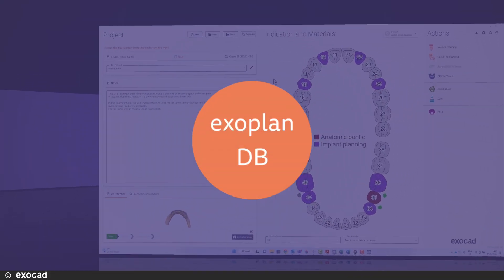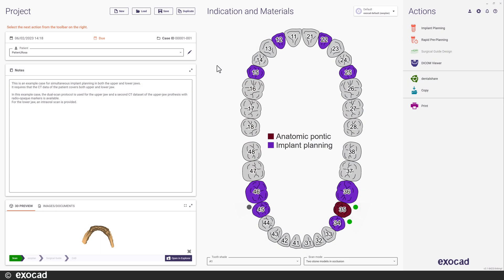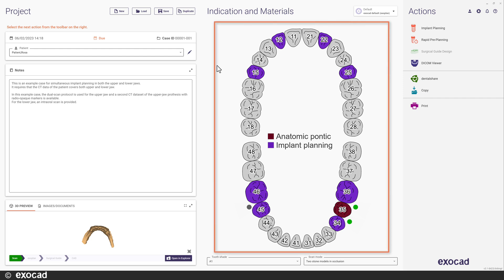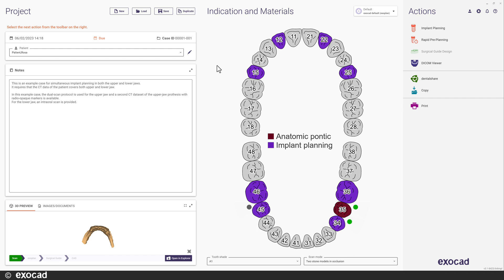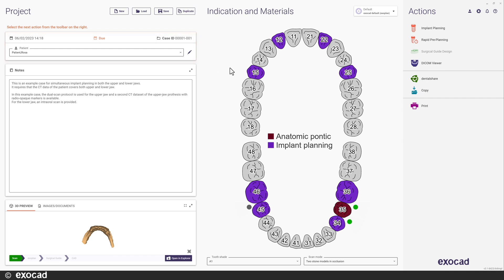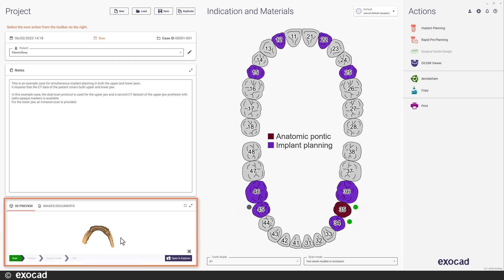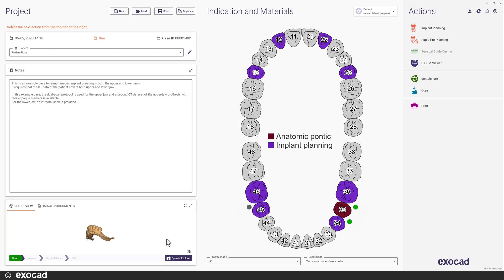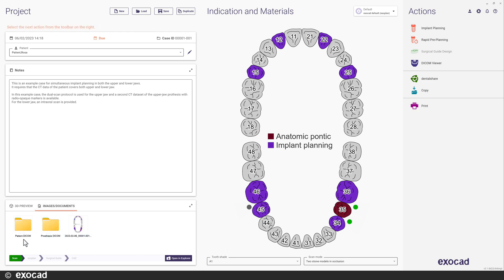Let's start in the Exoplan DB. One of our new key features in Exoplan 3.1 Rijeka is that it's now possible to plan for upper and lower jaw at the same time. For this video, I have loaded our demo case Patient Rosa, which is a case where the patient is edentulous in the upper jaw and has some residual dentition in the lower jaw. I have an optical scan of the lower jaw and as you can see, we now have a 3D preview of the optical scan data available directly in the DB. I also have the Patient DICOM and the DICOM of the prosthesis for the upper jaw.